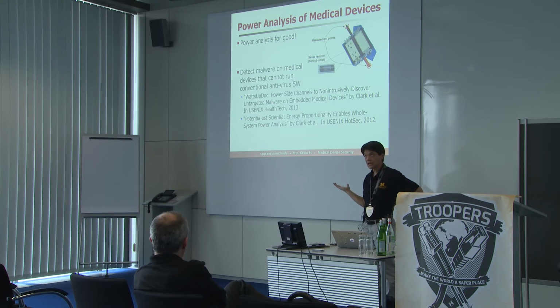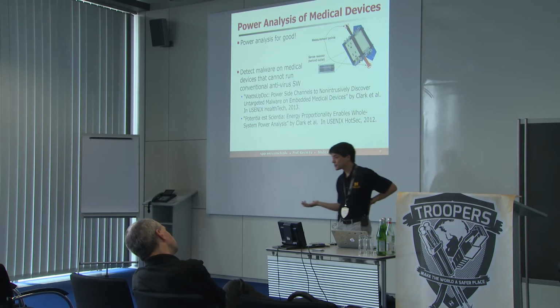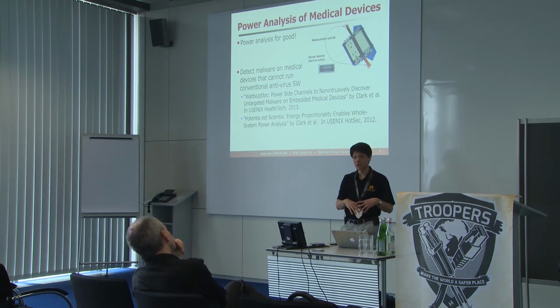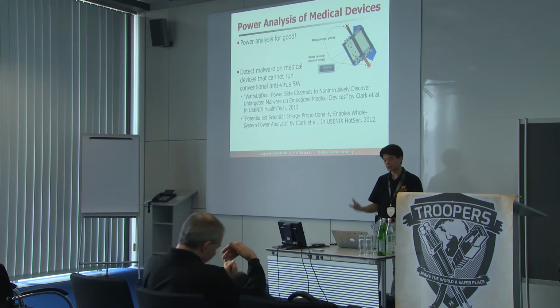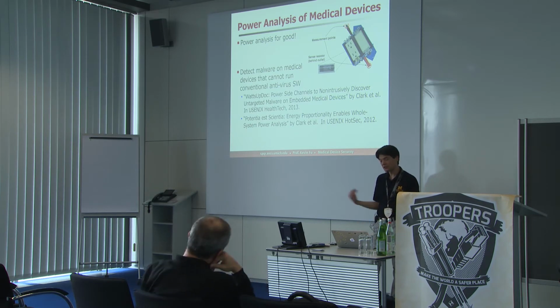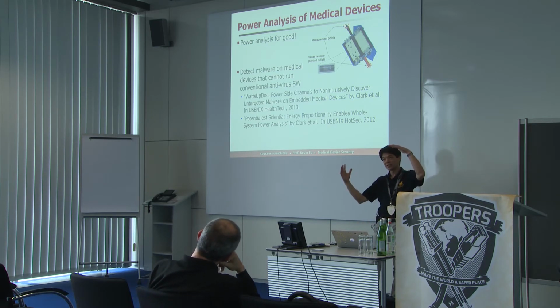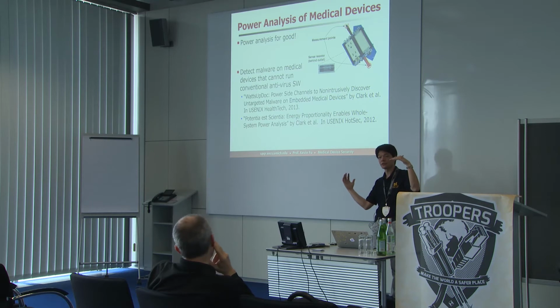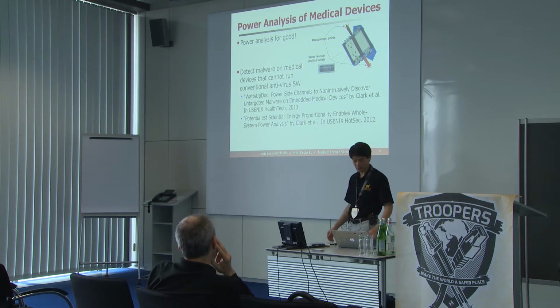But the reason why I personally think this is interesting is that in the medical device world, it is challenging to allow third parties to change software on the inside of the device because of the hazard analysis and the regulatory requirements. So the nice thing about this is it's outside, sort of the equivalent of your trusted computing base. It's outside your validated space, so it's not considered a medical device. So it's much easier to maintain in traditional IT ways.